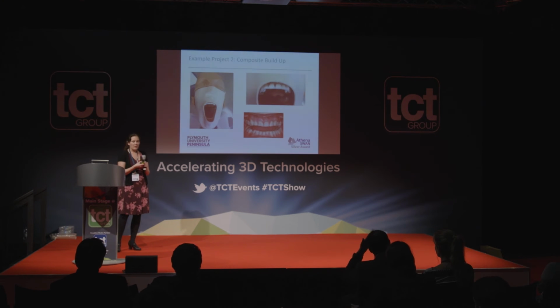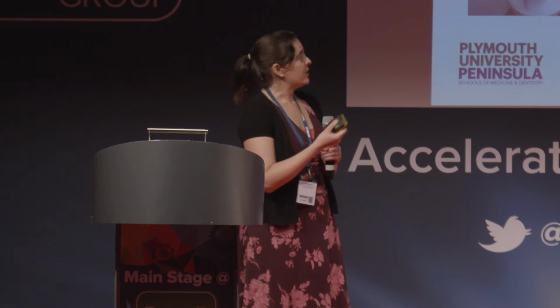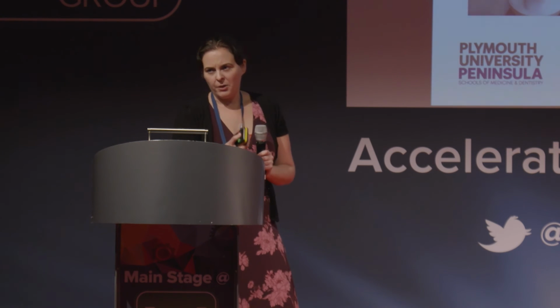I just want to talk quickly about two other projects that we've used 3D printing for. This is a composite build-up exercise that we do. The picture at the bottom there is someone who's got tooth wear. So that's someone who's perhaps ground their teeth and their teeth have started to wear down a little bit. And that's one of our patients there on the left in the phantom head room, and you can see that they also have tooth wear. What our students do is they practice building up these teeth using white fillings, white composite fillings.